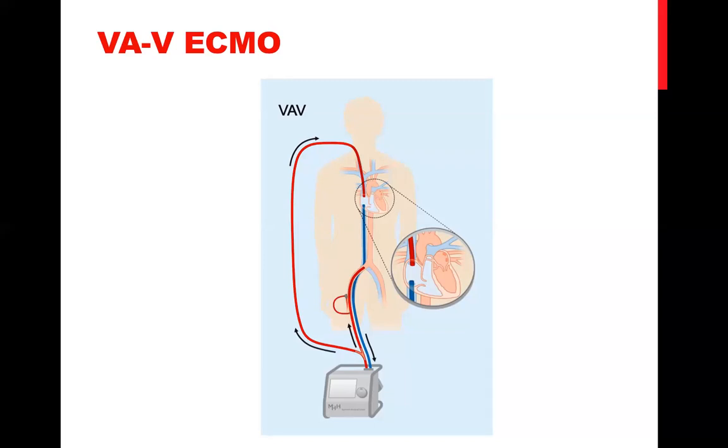The other alternative is you lower the peripheral vascular resistance by giving anti-hypertensive medication, mainly when you are in the ICU with these machines. Nipride and nitroglycerin are the drugs of choice utilized in the CSICU, mainly Nipride. You lower the vascular resistance, and that will give the chance for the outflow from the ECMO to reach everywhere. The second thing is you increase the flow of the ECMO, so you simply empty the heart, and you end up with an ejection of 500 versus 4 liters of the ECMO. So these are the two alternatives, but if the heart recovers, do not wait long. You avoid a complication by simply converting it into veno-venous ECMO. Thank you. Thank you, Doctor.